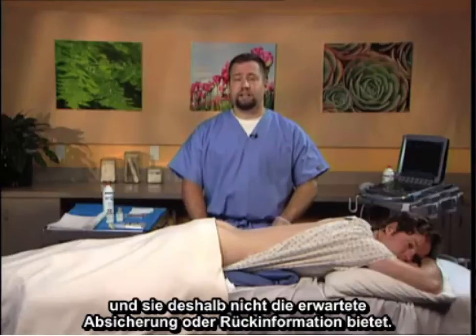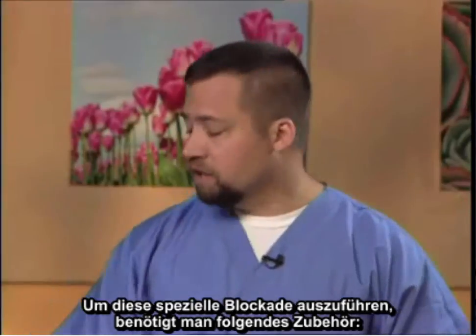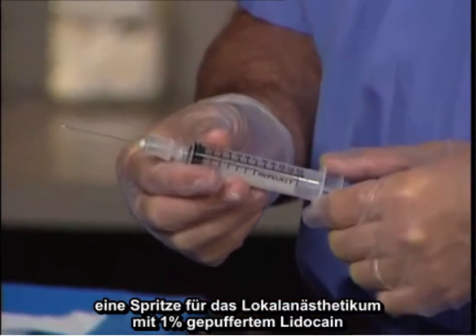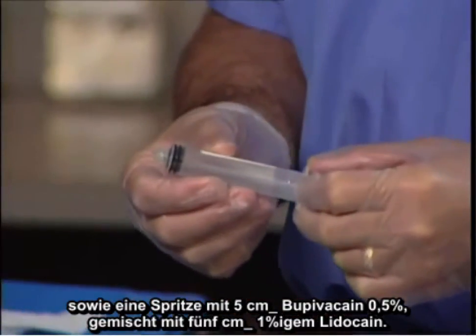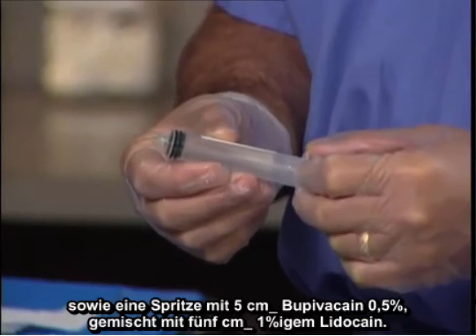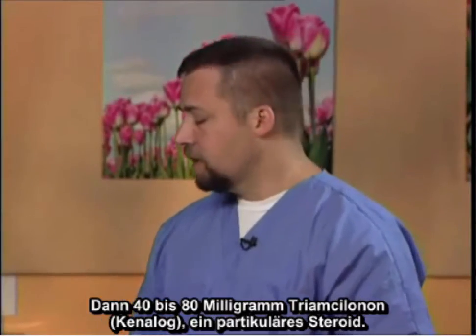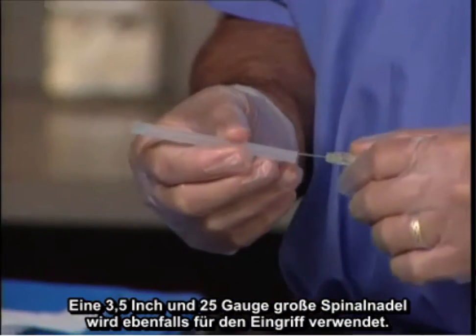To perform this particular block, the following equipment is necessary: chlorhexidine for sterile technique, a local anesthetic syringe containing one percent buffered lidocaine, a syringe containing five cc's of bupivacaine one half percent mixed with five cc's of one percent lidocaine, and then 40 to 80 milligrams of triamcinolone — Kenalog — which is a particulate steroid. A three and a half inch, 25 gauge spinal needle will also be utilized for the procedure.